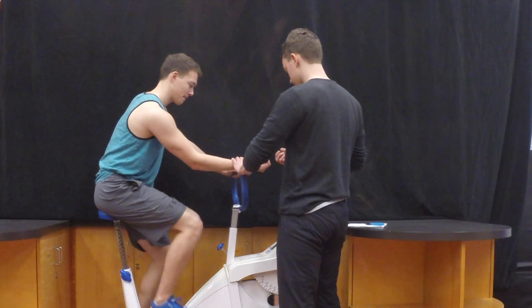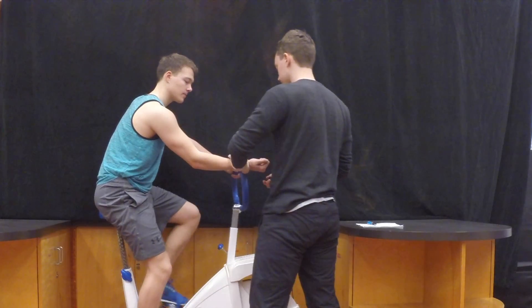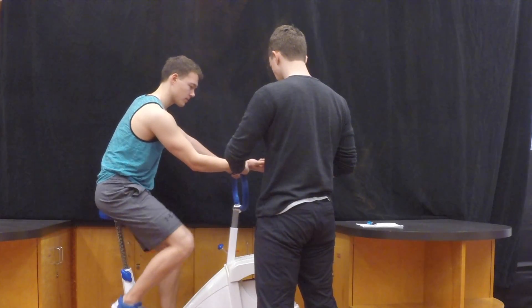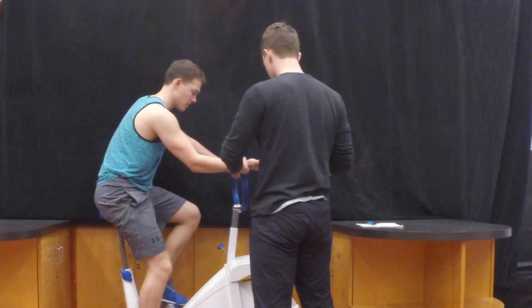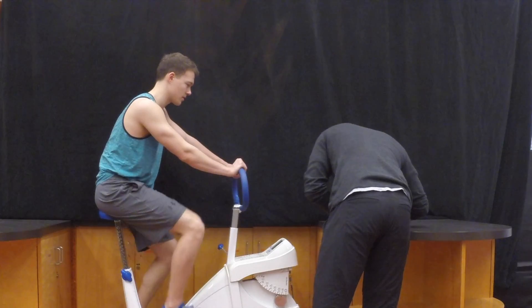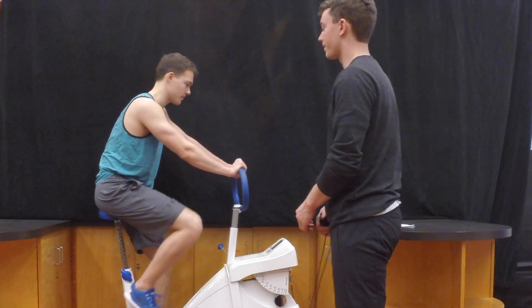Take the average heart rate of minute 5 and minute 6. If steady state heart rate was achieved — meaning a variance of less than 10 beats per minute — then the test is now complete. If steady state heart rate was not achieved, extend the test minute by minute until it is.